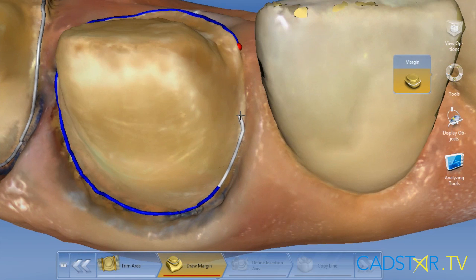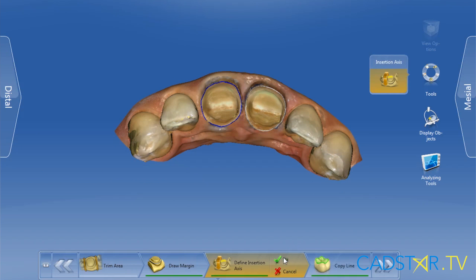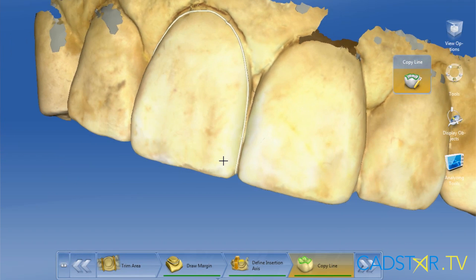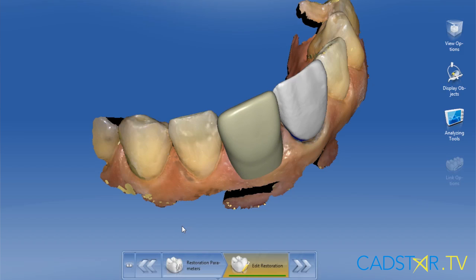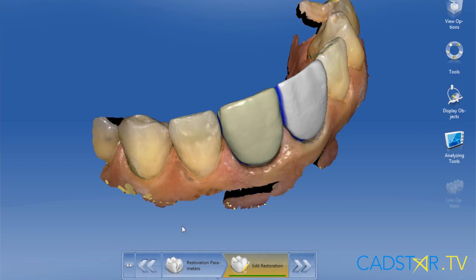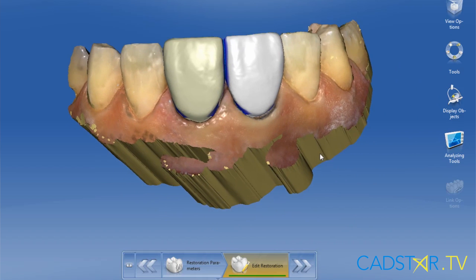The way to accomplish this is to follow three steps when you're using biocopy: draw the margin, set the insertion axis, and then refine your copy line. Don't hit the forward arrow until you've accomplished the three tasks on all the teeth on your tooth docking bar. A nice feature of biocopy when working on anterior multiple teeth is that's the way I translate my F-point and my midline to my virtual design.